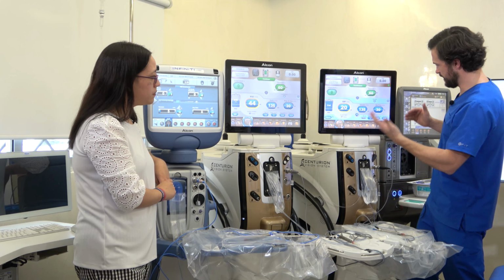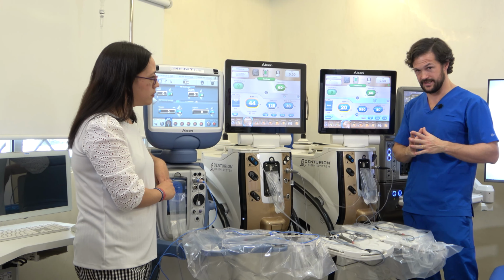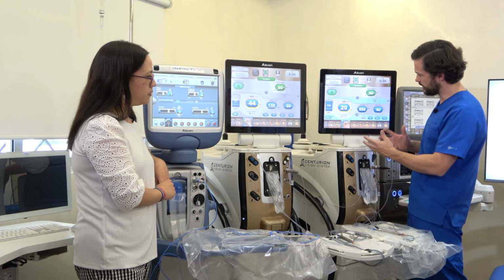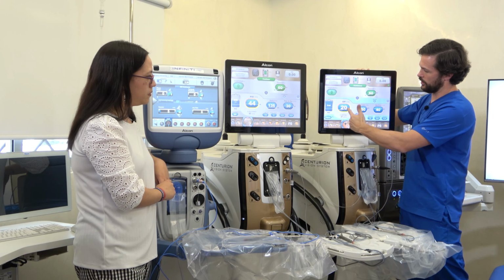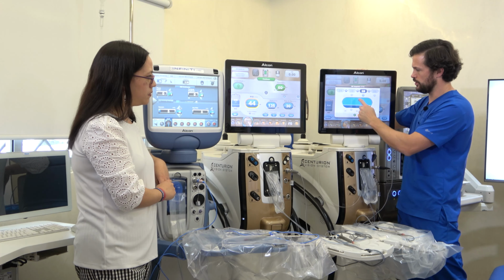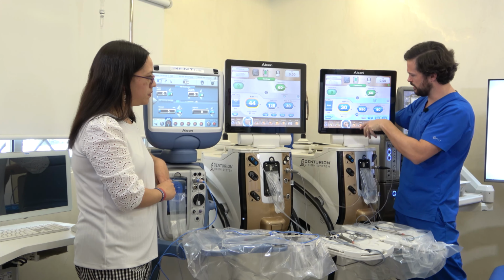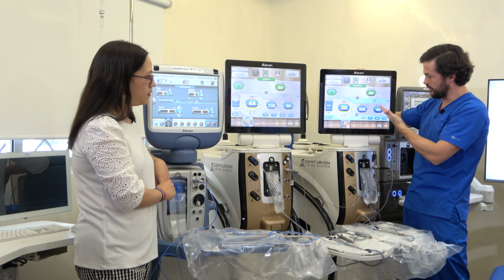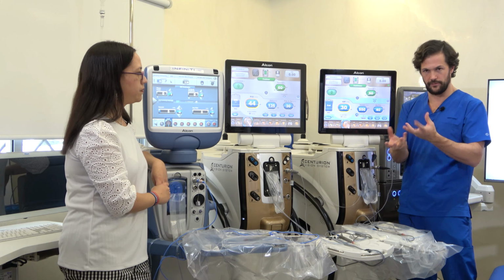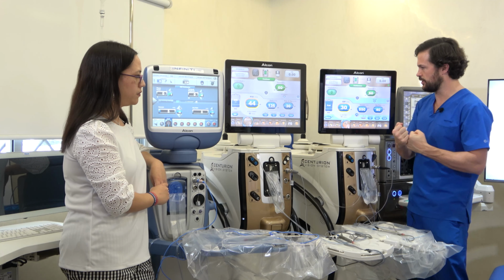Excellent. So let's go now to quadrant removal. In quadrant removal, the concept is that fluidics are king. Ultrasound should be only used to deocclude that tip. Because we're going to IOPs of 20, maybe you can start with IOPs of 30 to be more comfortable, more safe, but the machine will allow you to go that deep. The important thing here is to have a correct aspiration flow that is fixed, so the machine is moving and attracting things to the phaco tip, and also a vacuum that, when you're occluded, is sufficient to remove the material.